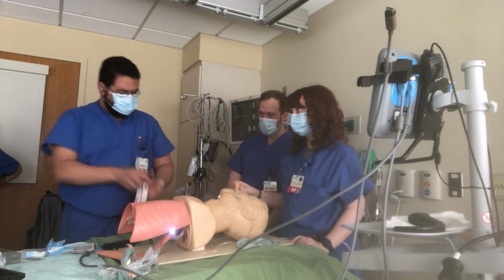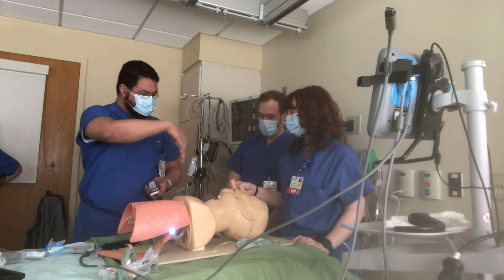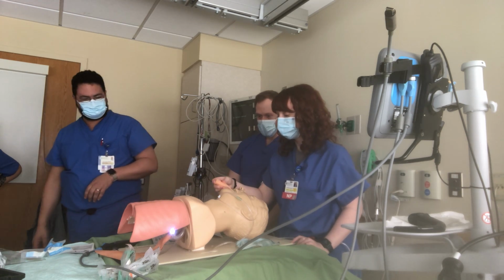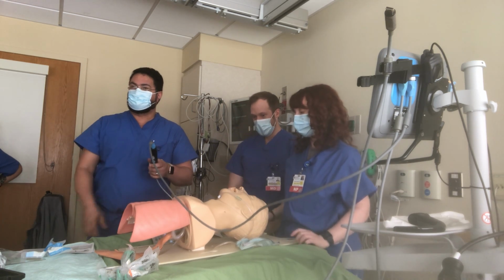But before we put it, we put this paste all the way here. So even if there's anything missing from the numbing, this will actually sit on the tongue and it doesn't feel. So let's put it in the middle. Right? So now we're almost getting ready. We put all the numbing. What else is left there?